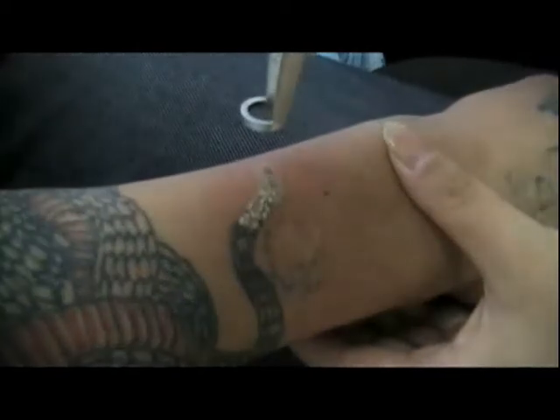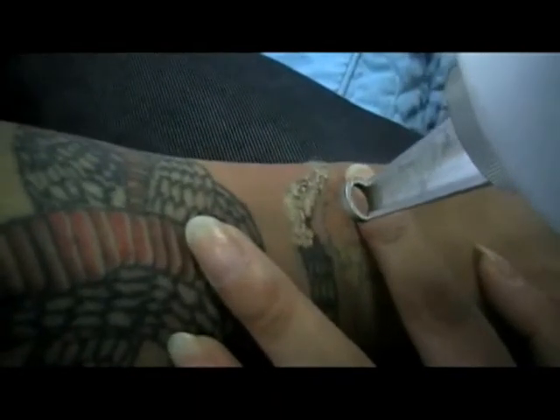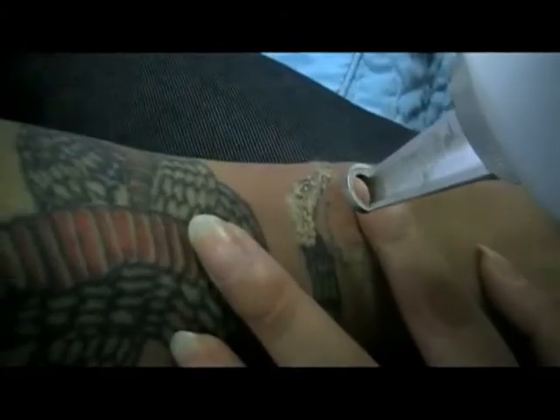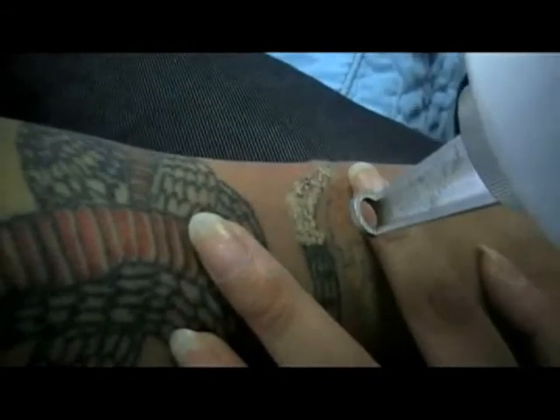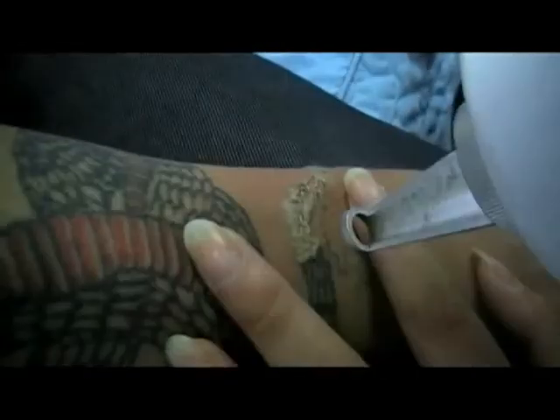4. Set frequency and energy, then launch the machine. 5. Keep the handpiece aimed at the treatment skin perpendicularly and treat it with the focus of the laser beam. Normally, patients will feel mild tingling.